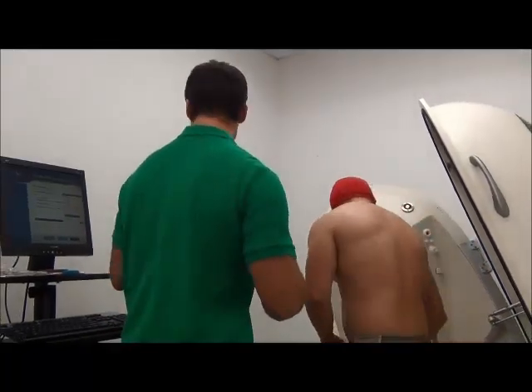Curtis is prepared for the assessment. The first thing we already did was measure his body weight. If we want density, we need to know body weight and volume — we got body weight by having him step on a scale. The bod pod will now tell us Curtis's volume.